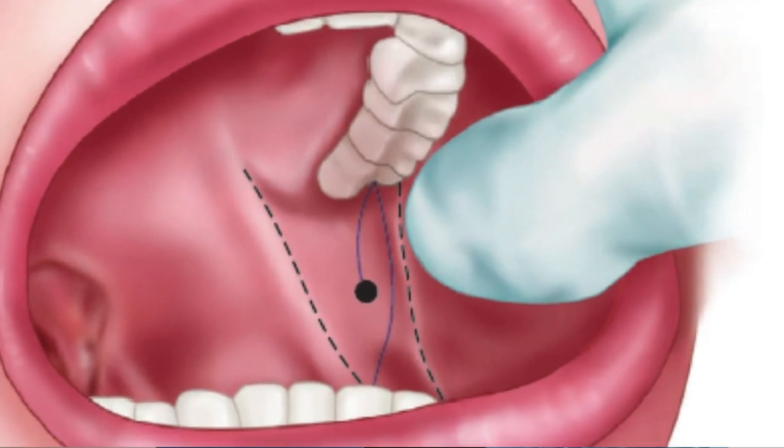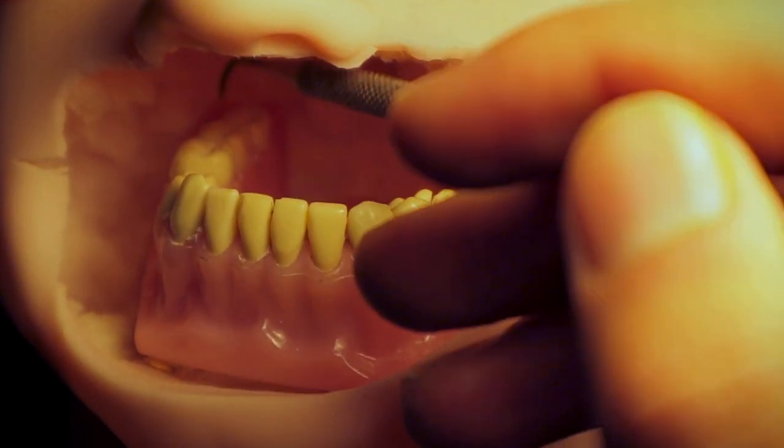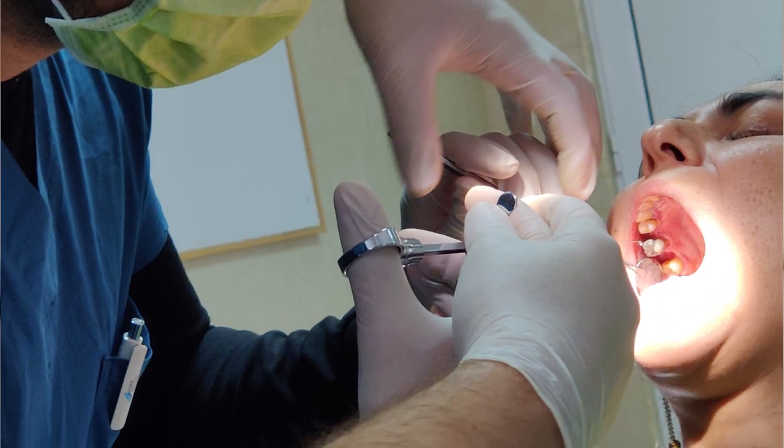To find the point of insertion for the inferior alveolar nerve anesthesia, I palpated with my thumb the medial and lateral oblique ridges of the mandible and found the coronoid notch. This determines the height of the point of insertion, which is basically midway through your thumb. The point of insertion is a few centimetres medially to the thumb. I angled the injection towards this point of insertion from the contralateral canines, inserted until bony contact, withdrew slightly, aspirated, and then injected — about two thirds of the carpule.